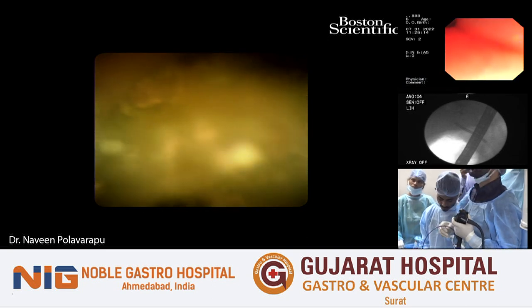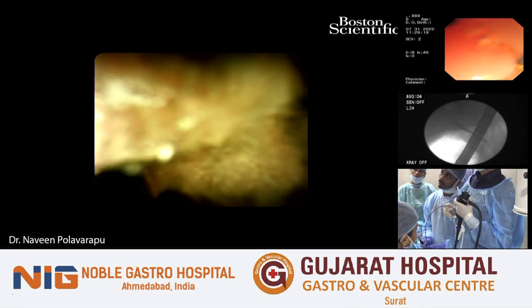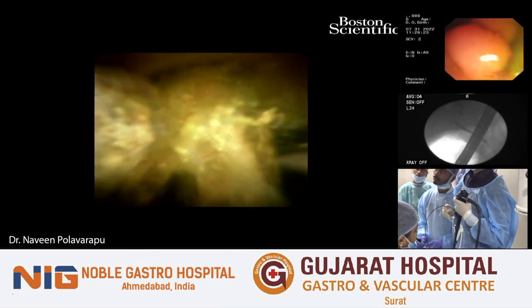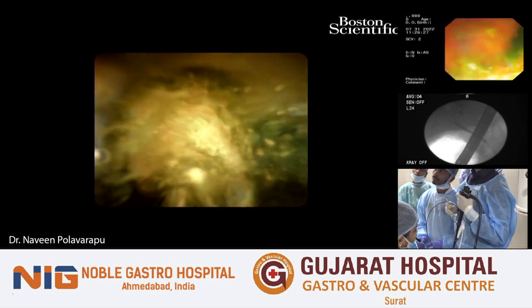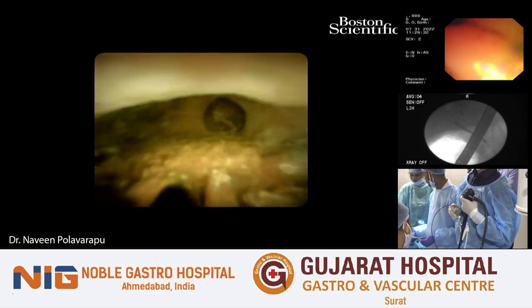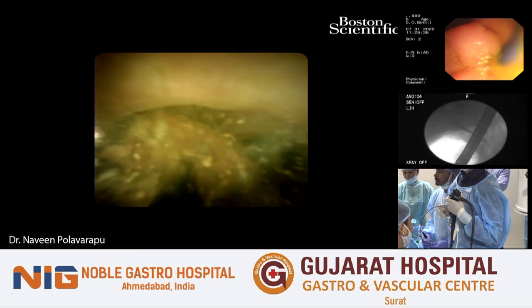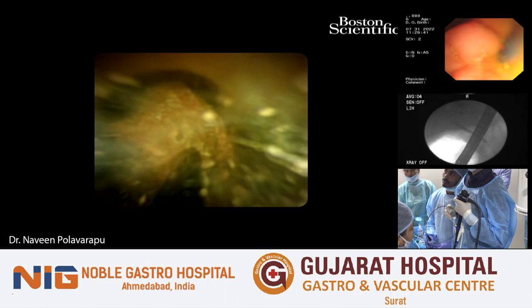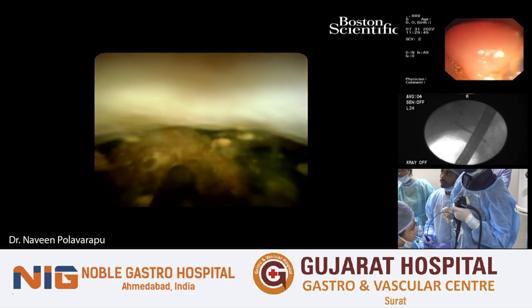Let me just flush a little bit and then see. So, Dr. Naveen, what are the settings of the EHL machine you have kept to break the stone? It broke very easily. So, can you enlighten us on that? Yeah, we put a setting of 3 joules, 3 pulses, I mean, sorry, and low power. And the trick is don't keep pressing on it. You had to give some time between the pulses. You are creating a crater-like thing over there. Yeah, that's right.